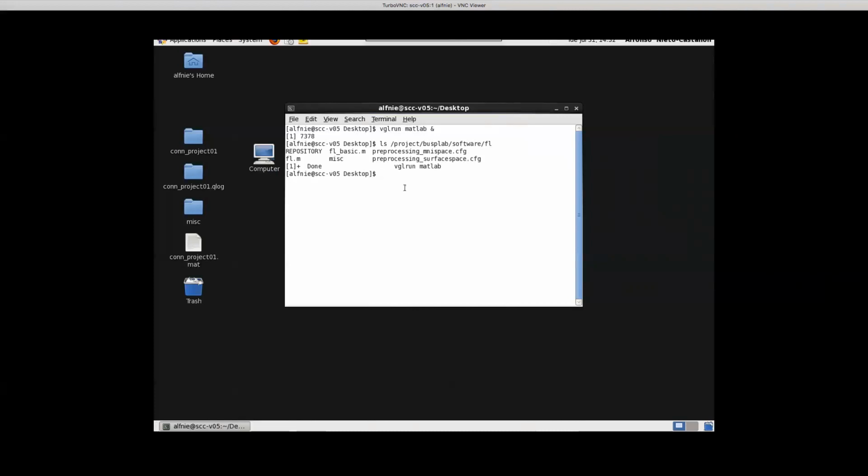So how would you suggest we organize it? Having 3 preprocessing pipelines, one for MNI direct normalization, another for MNI indirect normalization, and another for surface, like FreeSurfer type analysis? Yes, that's what I would suggest. This is based on our conversation from last week. Yeah, right, I recall this. I didn't get to do that change, but that makes a lot of sense.